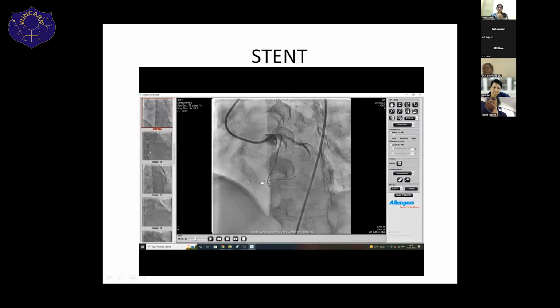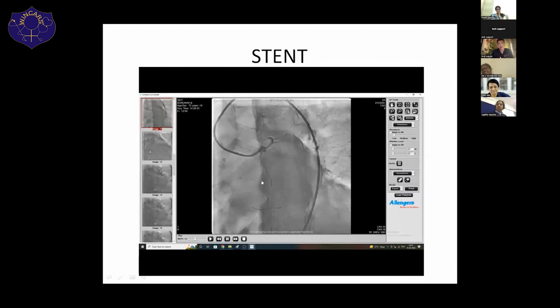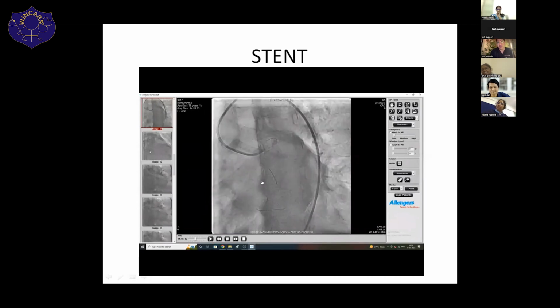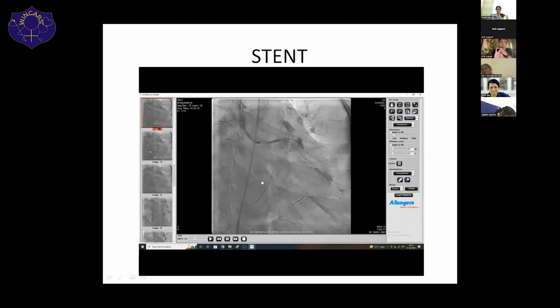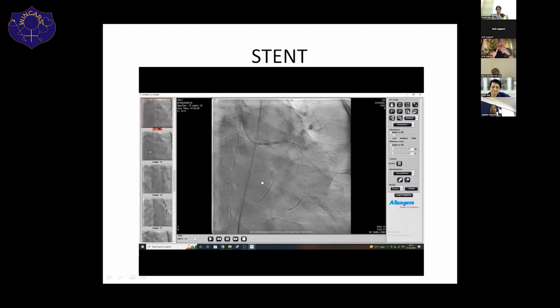Yeah. In the meantime, Dr. Ankush. So, Dr. Gauri, heartiest congratulations for such a difficult case, that too in an ACS scenario. And let me assure you, the patient was not dependent on LCX. He was depending on you actually, he or she, whatever. Number one. Number two, in this case, the patient had ACS, anterior wall MI, left dominant, left main disease. And I was sure that there was calcium.